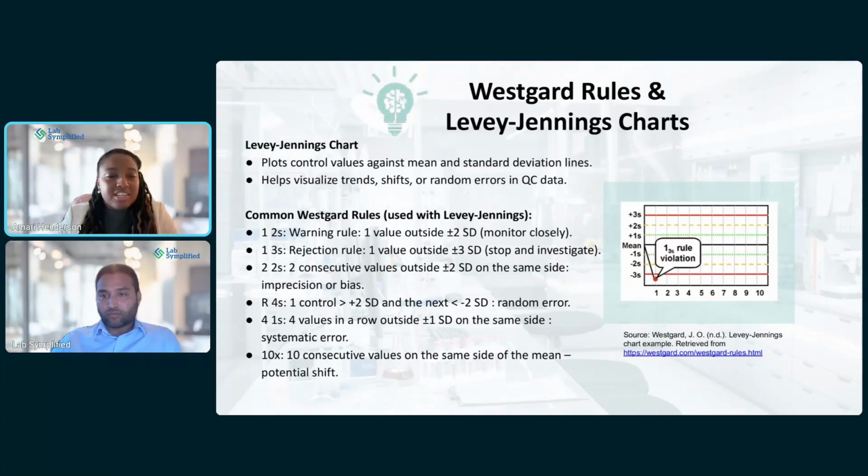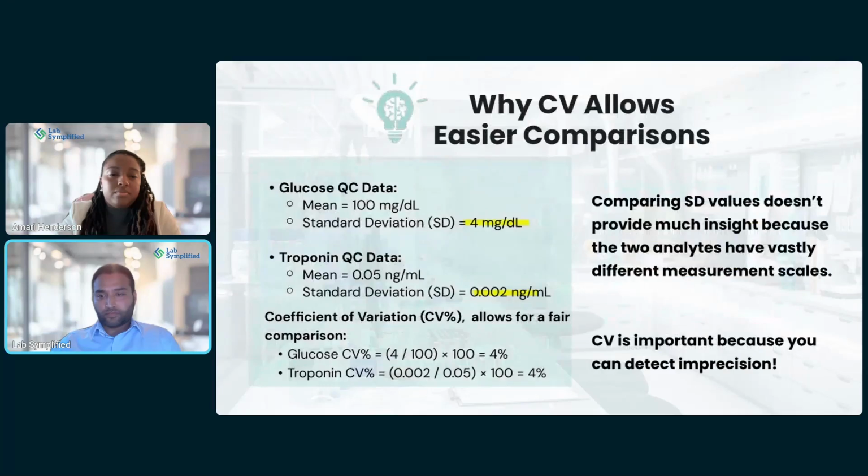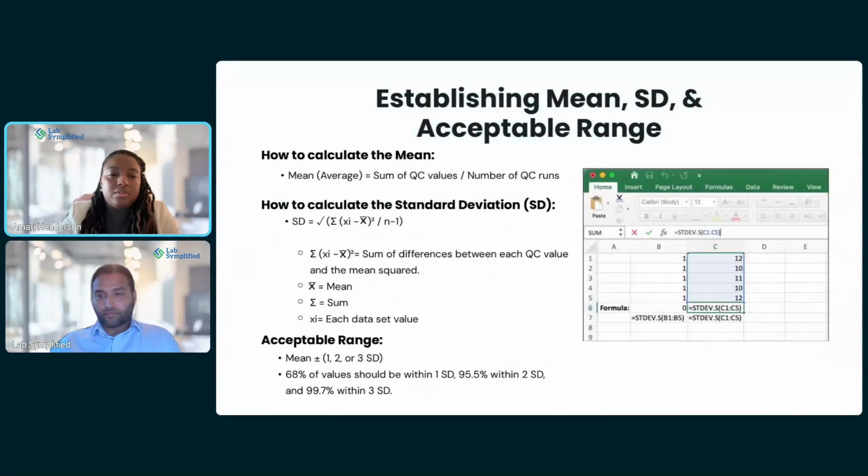Whereas a trend is going to be a little more gradual. It's not going to be as obvious to pick up on. And it's just, like I said, going to happen over time. And those can be due to certain things like changes in your environment where your instrument is placed, or maybe a lamp change or something that gradually happens over time. So I'm going to go back.